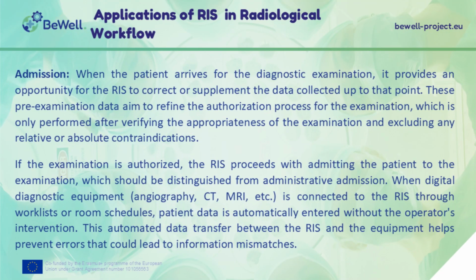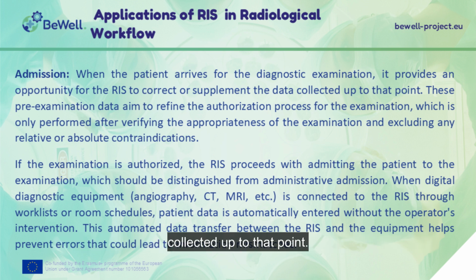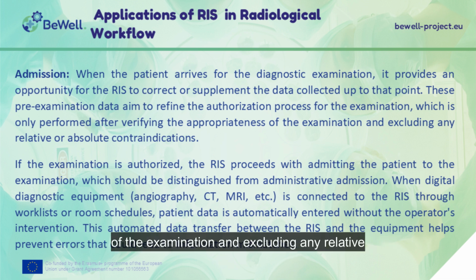Admission. When the patient arrives for the diagnostic examination, it provides an opportunity for the RIS to correct or supplement the data collected up to that point. These pre-examination data aim to refine the authorization process for the examination, which is only performed after verifying the appropriateness of the examination and excluding any relative or absolute contraindications.